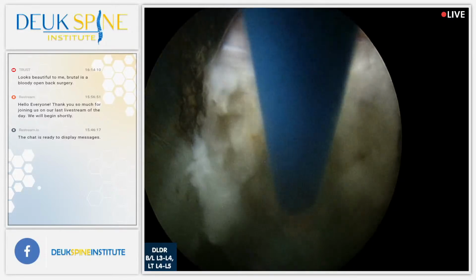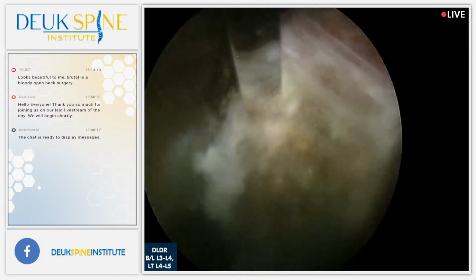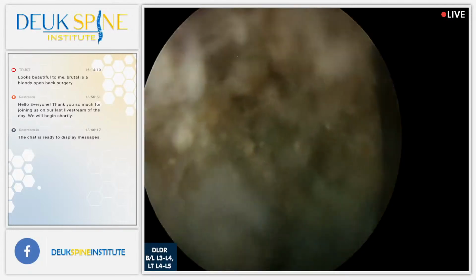Luis, I'm not getting to 12 o'clock for some reason. Yeah, that's a little better, yeah. Let's see, grab her.